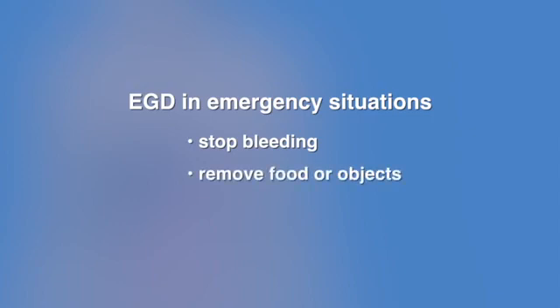An EGD can be recommended as necessary to treat some problems. With an EGD, a surgeon is often able to stop severe upper GI bleeding. In other situations, food chunks and other stuck objects can be reached and gently removed. An EGD can also be used to stretch and dilate an esophagus that is narrow from scar tissue or other problems.